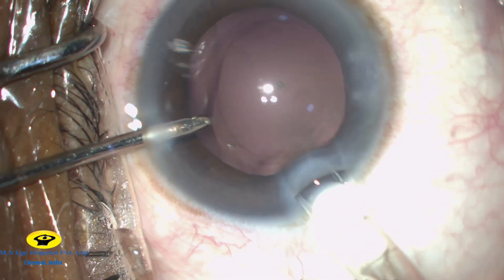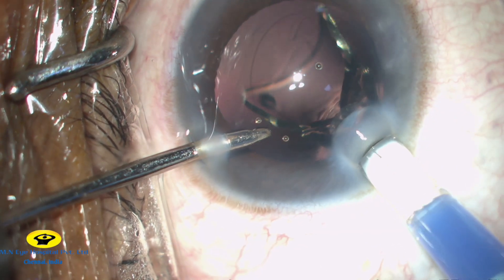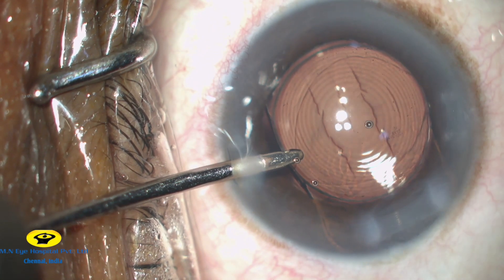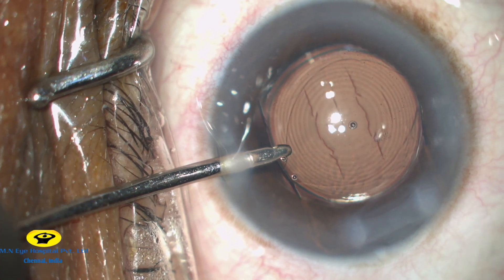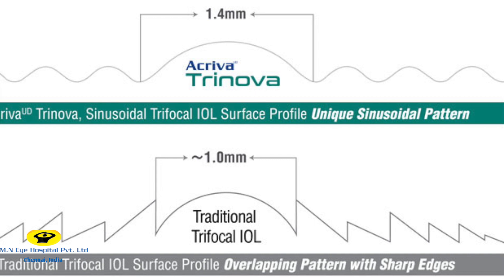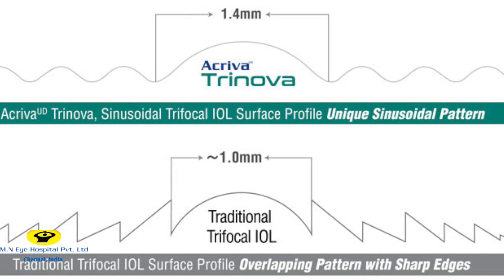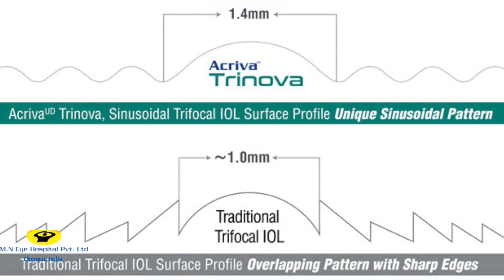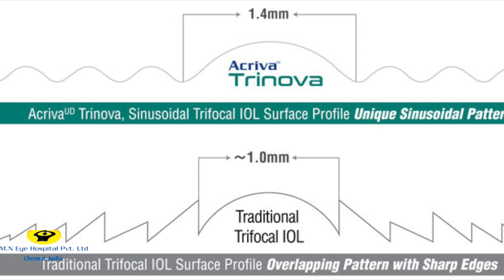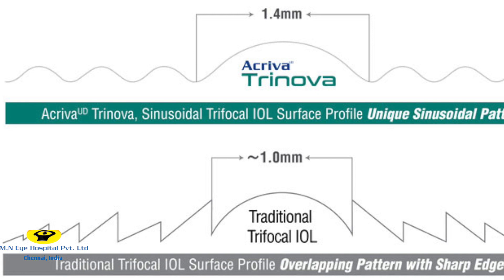Under irrigation, the Trifocal IOL is then injected into the capsular bag. The Trinova has a unique IOL optical surface that does not exhibit any sharp edges, and the lens shape is derived from sinusoidal functions resulting in smoothly varying surface profiles, which largely reduces the incidence of halos and scattered light.